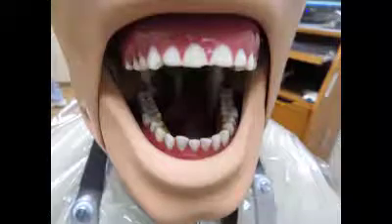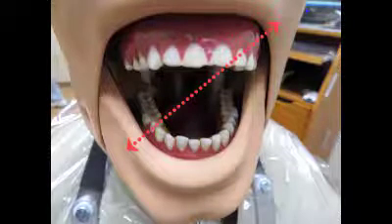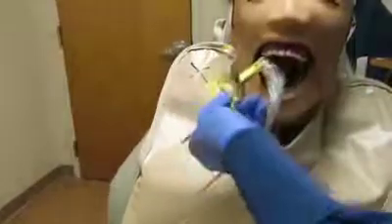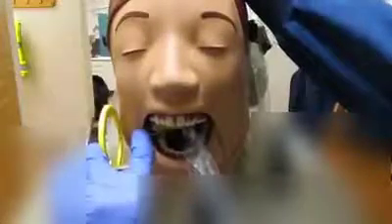After completing the maxillary premolar exposure of one side, move to the mandibular exposures of the opposite side. In this case, we will continue with the mandibular right molar exposure first. Center the receptor at the mandibular second molar. Position the receptor away from the teeth and towards the middle of the tongue or the floor of the mouth.